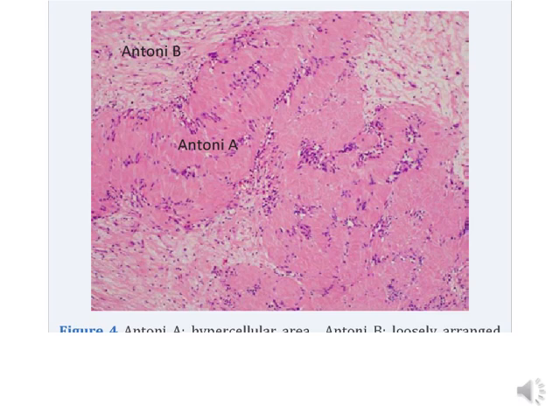It shows a fibrillary tumor formed of Schwann cells, having alternating areas of hypercellular and hypocellular or haphazardly arranged spindle cells. The hypercellular areas, as shown here, are formed of palisading or parallelly arranged spindle cells with wavy nuclei, called Antoni A. The Antoni B areas are formed of those spindle cells but haphazardly arranged.